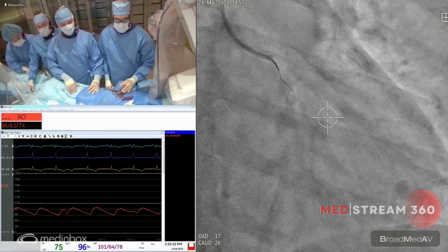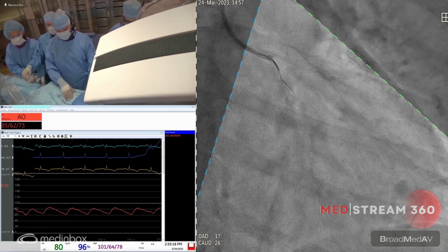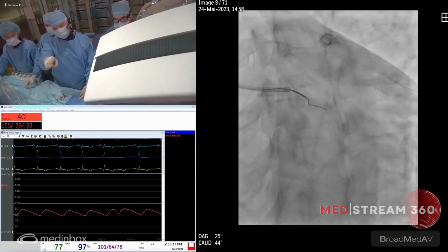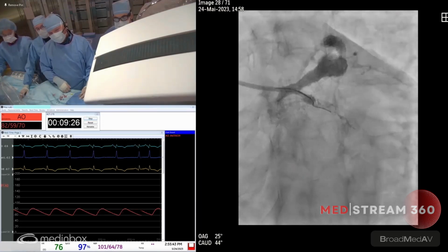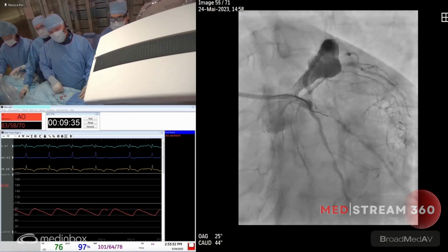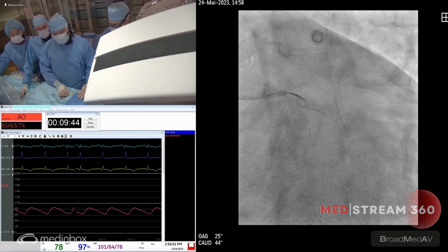Spider. And then that gives you another appreciation of the angulation for your wire. And before pushing with the stronger wire, I like to see both views. Well, there's still quite a long segment. So one problem is that with the aneurysm, when I put the microcatheter, it's not going in the right direction, and it pulled back my wire because of that. So we may work with it and try to put it in the distal part of the aneurysm. Yeah, because I lose a lot of power. Pushability. Okay, so that helps.